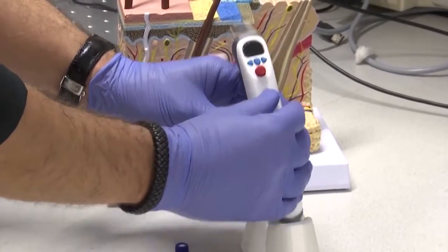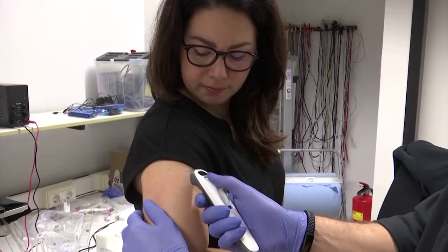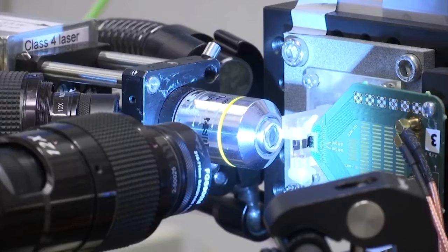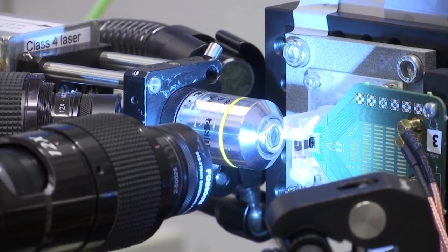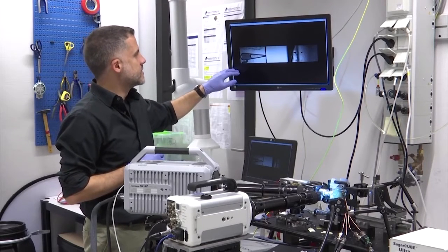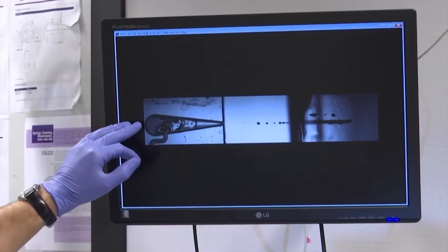Researchers in the Netherlands are developing virtually painless injections without needles, in what they hope is a breakthrough that will ease fear and encourage vaccinations. The bubble gun uses a laser to push tiny droplets through the outer layer of the skin. David Fernandes Rivas of Twente University and the Massachusetts Institute of Technology developed the method.